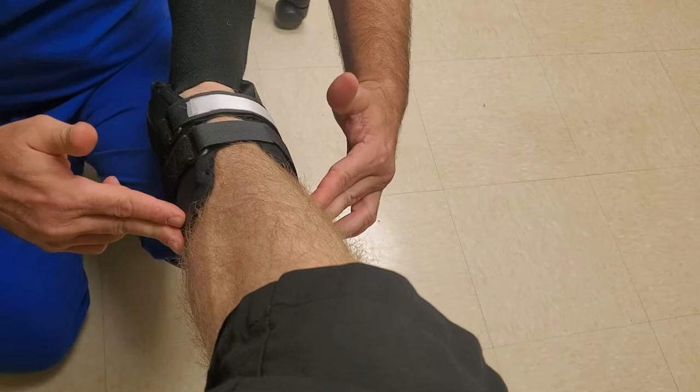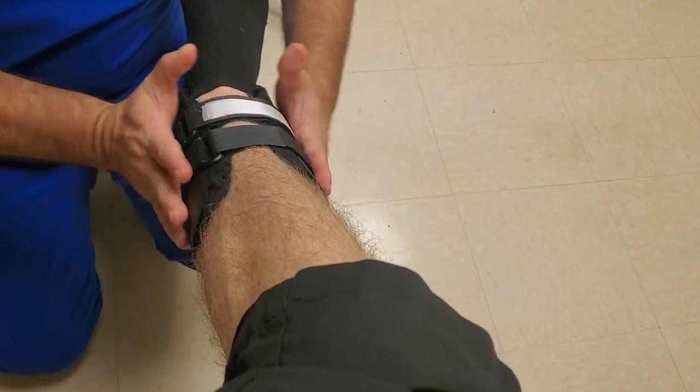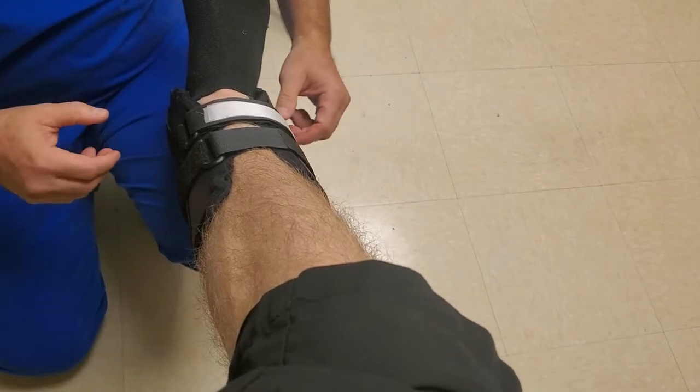I'll do that again so you can see — it opens up the bottom, and then your patient's wearing the brace essentially for nothing. That is the stirrup brace.